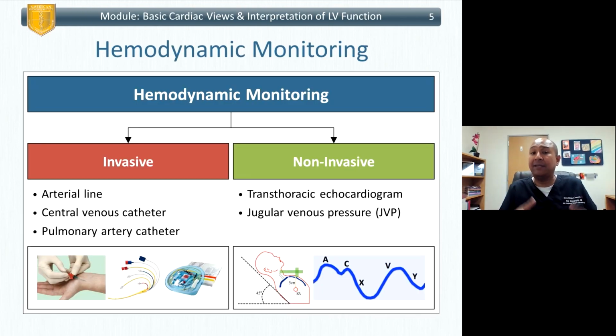really need to go back to the basics, which is, why are we doing this to begin with? And the answer is, well, for hemodynamic monitoring initially. There are so many other things, but remember, we're doing this for critical care right now. And in critical care, we love one thing, which is what? Shock.